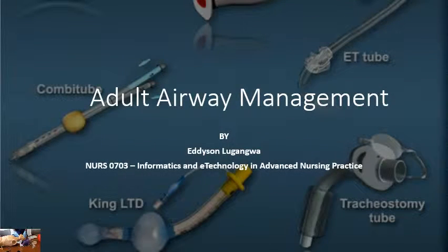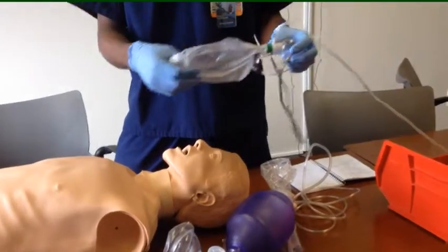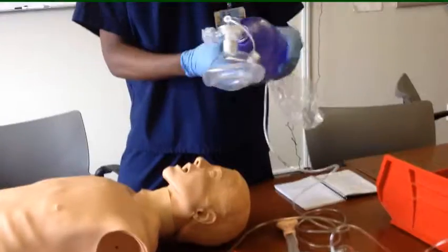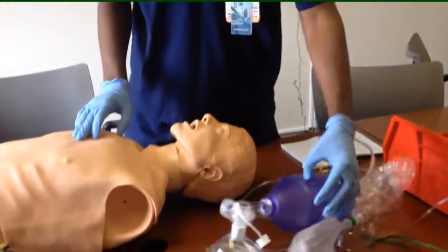I'm just going to be talking about airway management, because when the patient is, for example, in an emergency situation and cannot breathe for him or herself, we have to be able to provide positive ventilation. So first, looking at some of the important things you may need for airway, we have a non-rebreather mask. We also have an ambu bag, which we may have to use to provide positive ventilation to the patient in case the patient cannot breathe for himself.